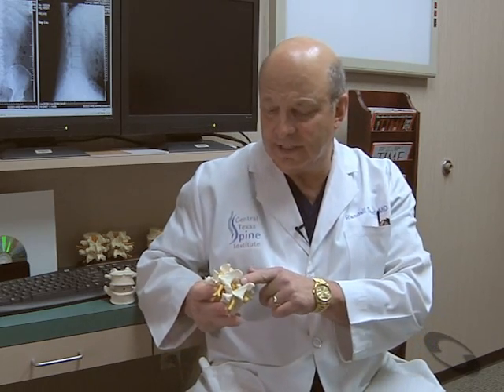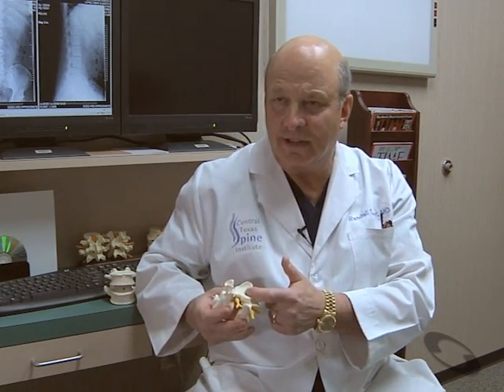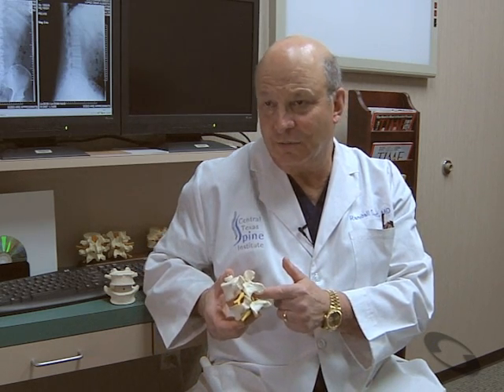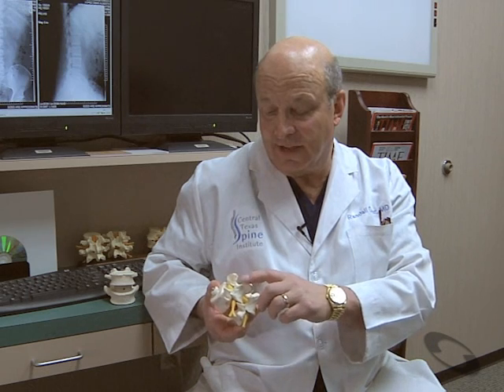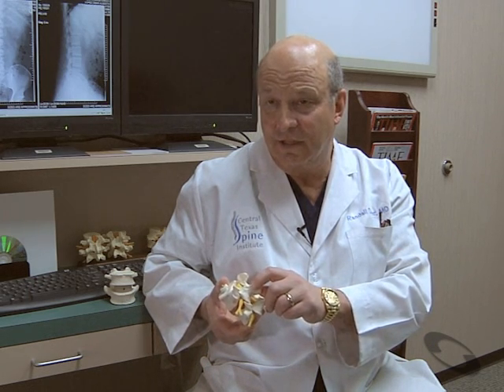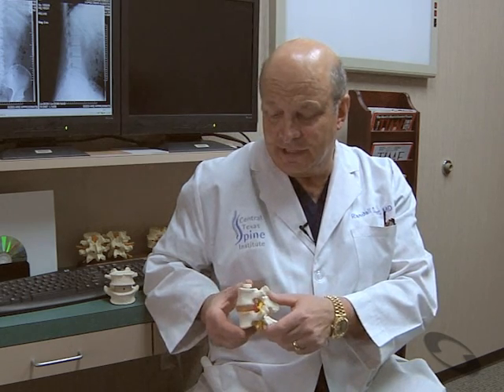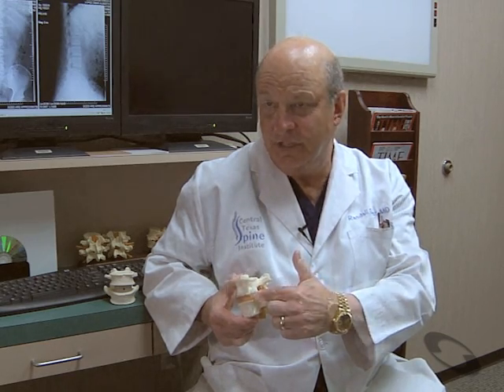I've used it as an individual posterior fixation device where I've taken off the supraspinous and interspinous ligament complex. I've removed some of the lamina. I've put posterior intervertebral cages in the form of a PLIF, and then I've locked this down with the coflex-F implant. Other settings where I've used this is if I've done a trans-psoas far lateral intervertebral cage.